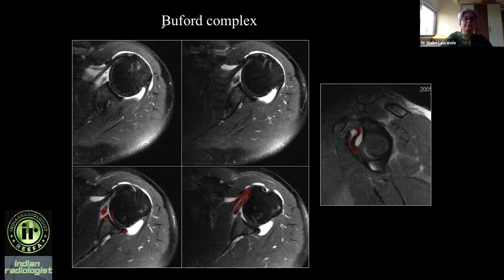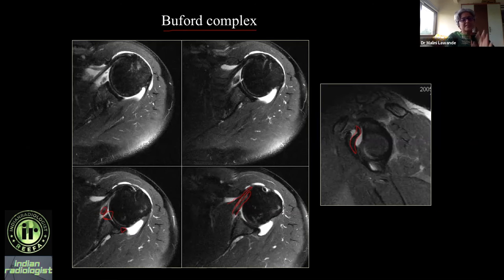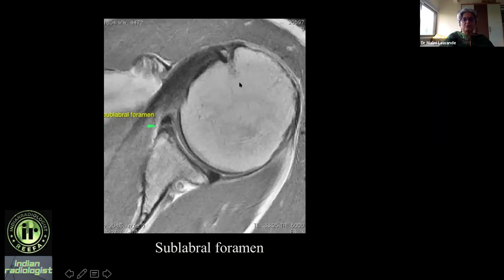This is a thick middle glenohumeral ligament and the anterior superior labrum is absent — a developmental condition called Buford complex. The anterior superior labrum can have many variants: it can be developmentally absent or hypoplastic. I just need to recognize the Buford complex and not confuse it with a tear.